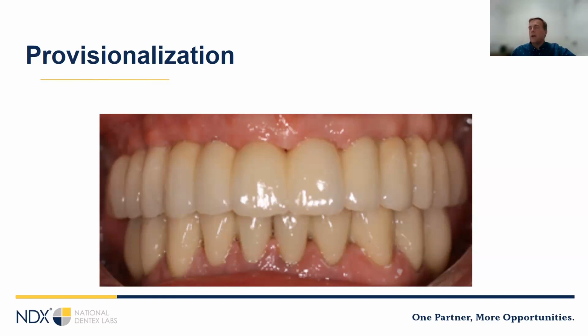So we went to a lot of time to get the right bite, get everything in the right position, and the poor person is tired, you're tired, everybody's tired. Sometimes what's good is to just make some rough adjustments and then tell the patient, come back in a couple days. At that point, they've had the opportunity to wear it a little bit.